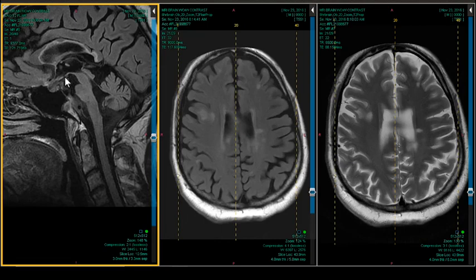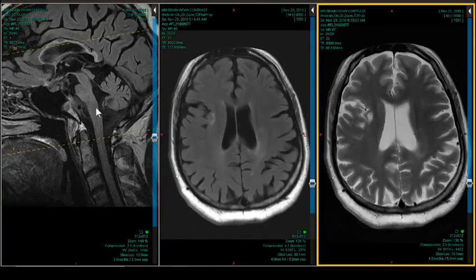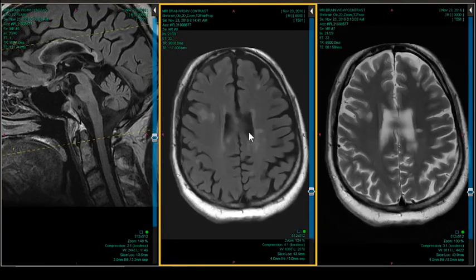Okay. All right. What's the answer, Dr. Schupek? All right, well, so a lot of findings. So, once again, elderly patient, so there's going to be all these things going on, some vascular, there's going to be some atrophy, okay? But the pattern, and also the predominant pattern, meaning where's the predominant pattern of atrophy?